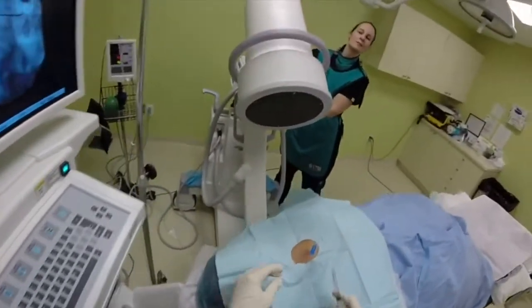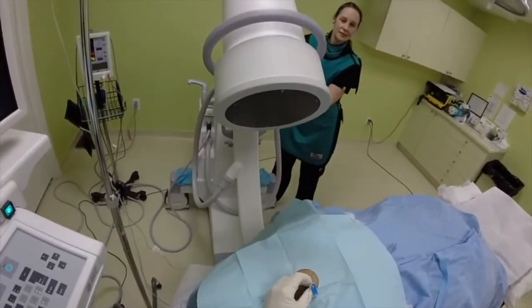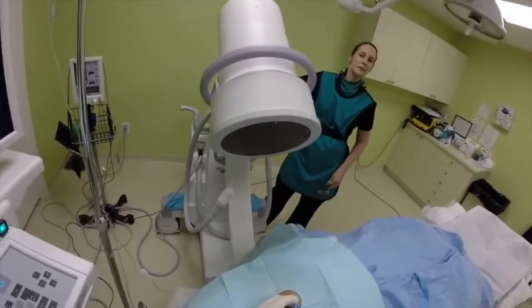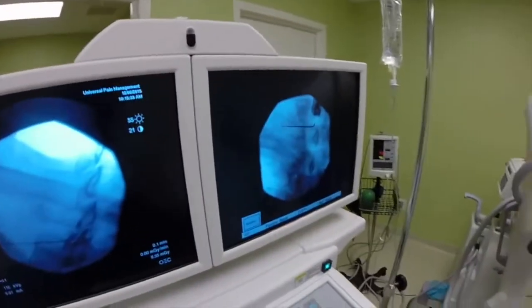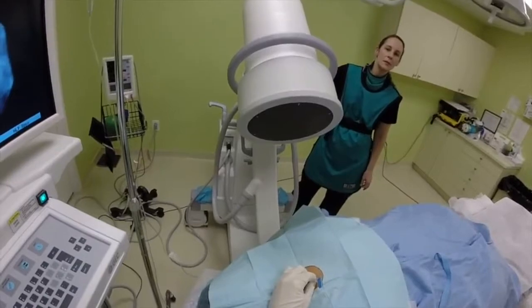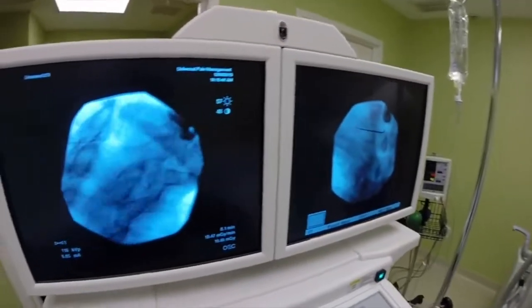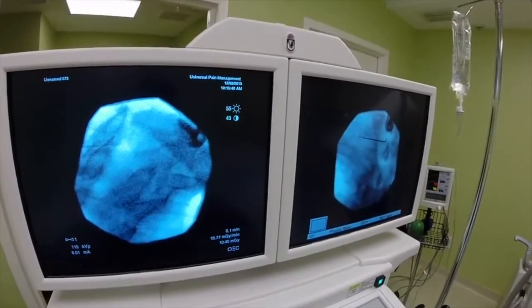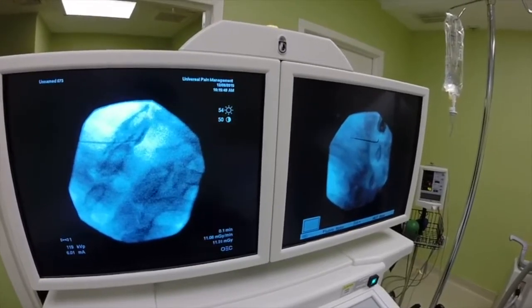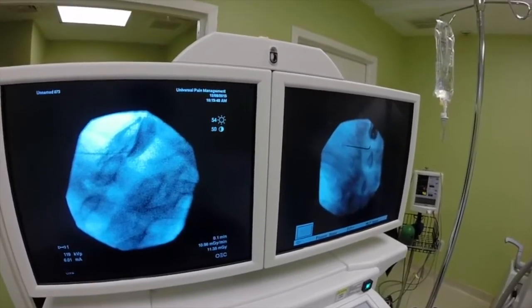For the purpose of this demonstration, I will use pulsed fluoroscopy and I will slowly advance my needle. Now you can see a big difference — you can see the medicine going to the epidural space.